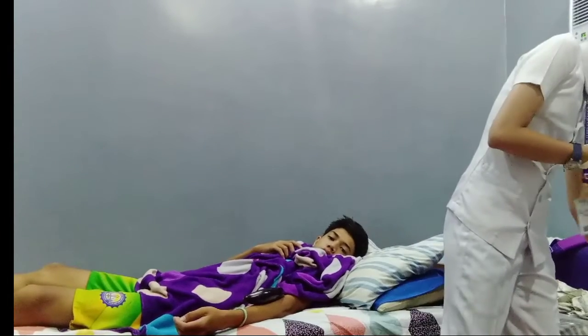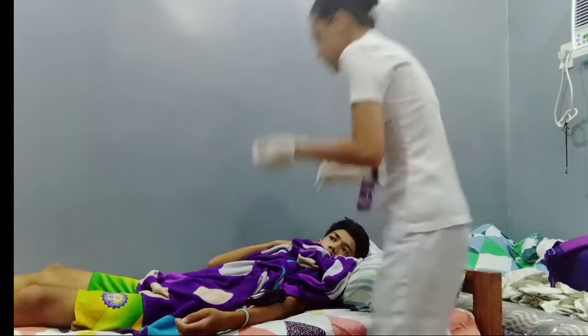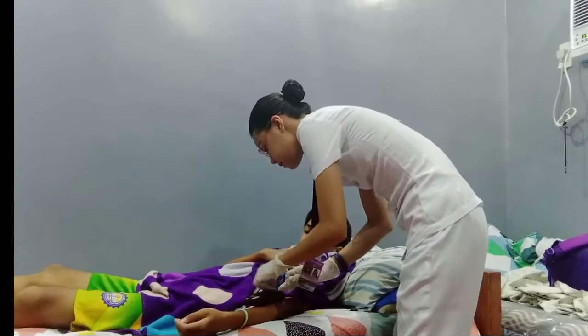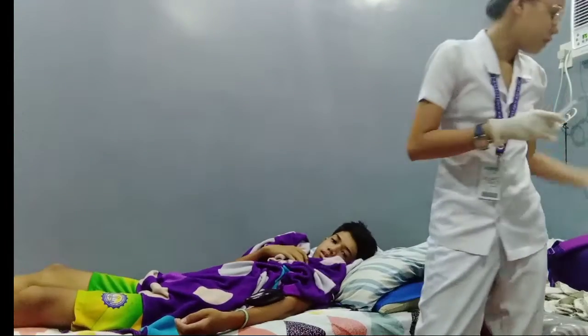So firstly, we need to clean the injection site. I don't have any antiseptic swab, so I will use 70% alcohol instead, in a circular motion. And we need to throw this in the receptacle bin.